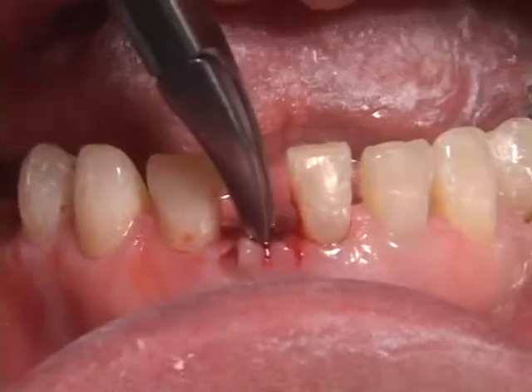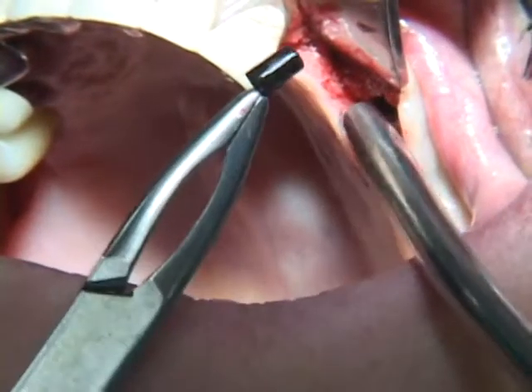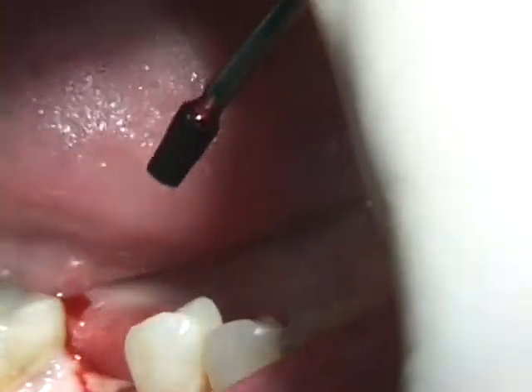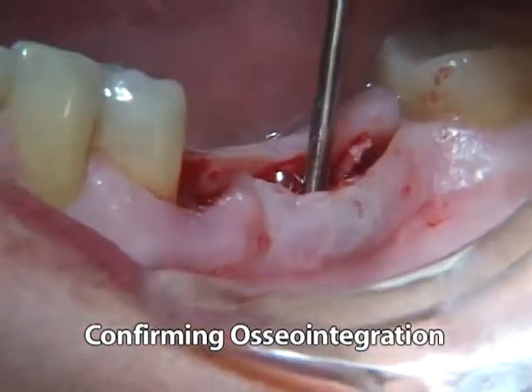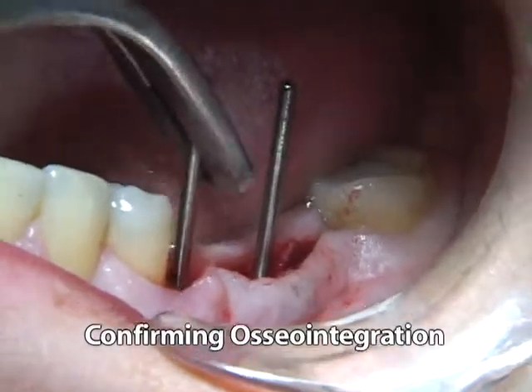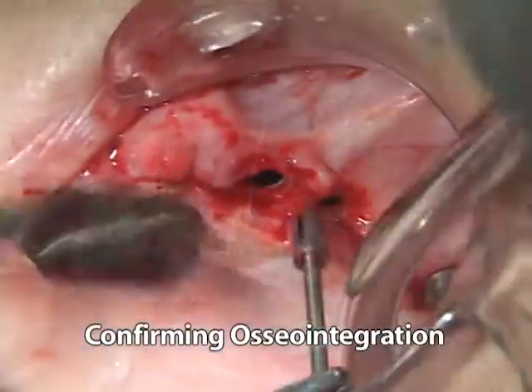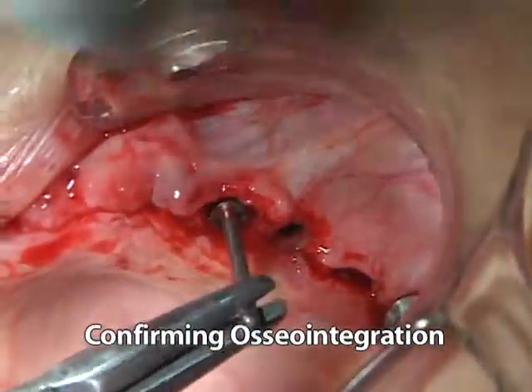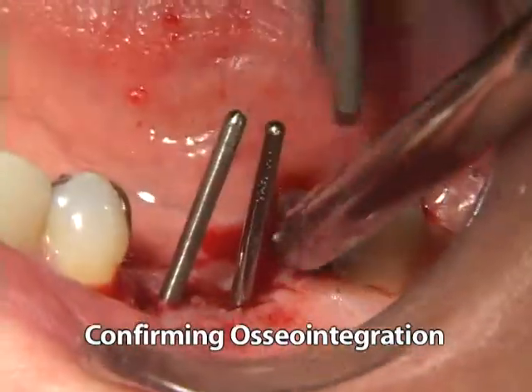Alternatively, the plug may be removed by grasping it with a small soft tissue rongeur or by engaging it with the number 4 round burr in a latch handpiece. After removal of the black healing plug, a guide pin corresponding to the implant's 2 mm or 3 mm well diameter is completely seated into the implant's well to ascertain the success of its osseointegration by evaluating its stability.